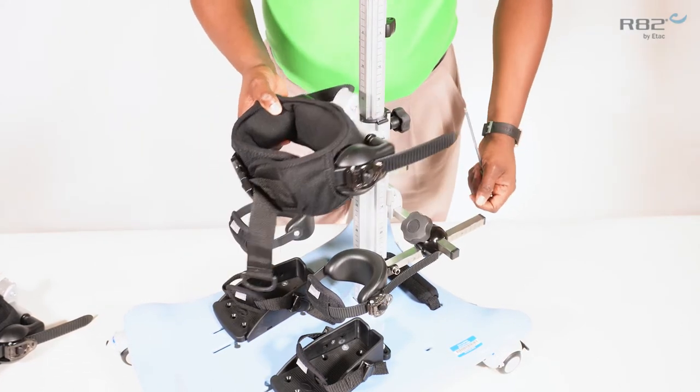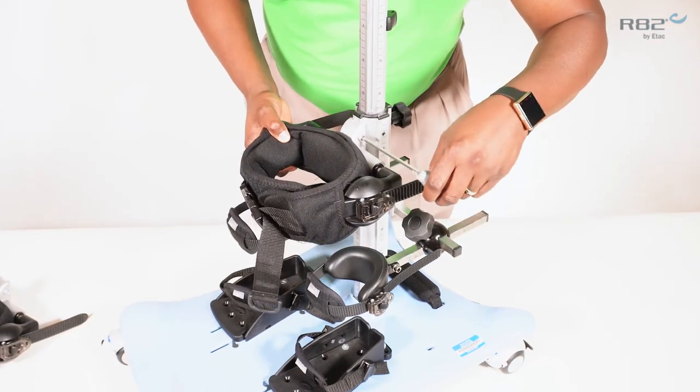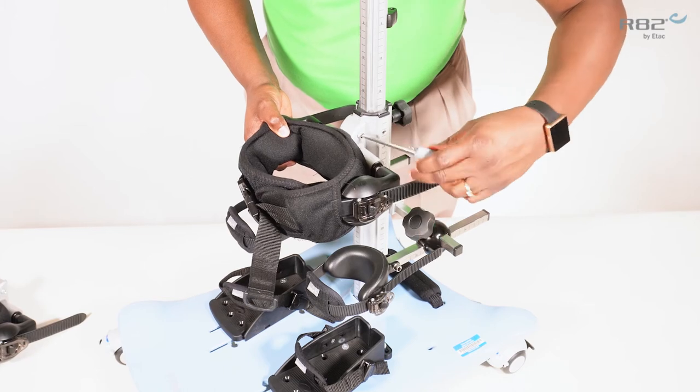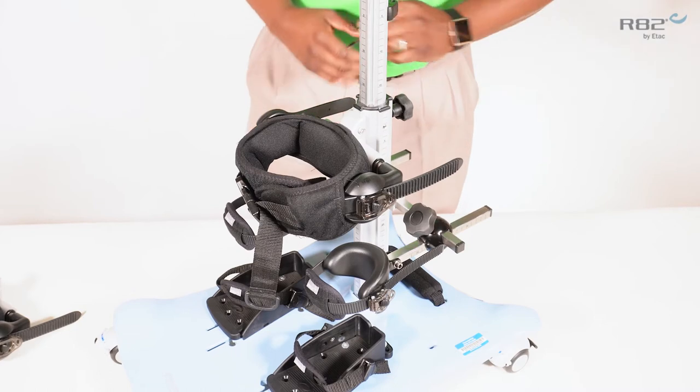Remember to loosen your bracket. Align the pelvic support with the column, and once you reach your desired height, simply tighten your pelvic support in place.